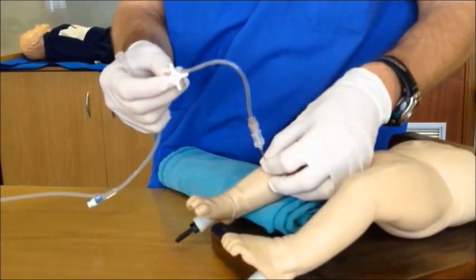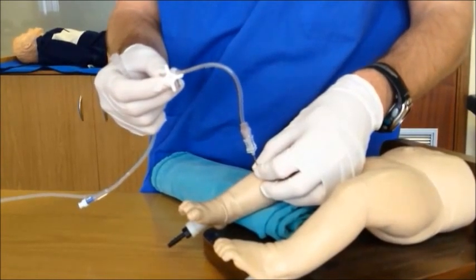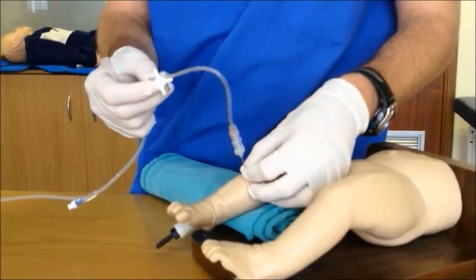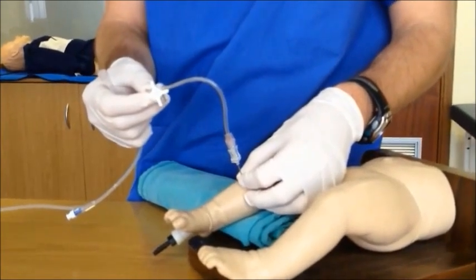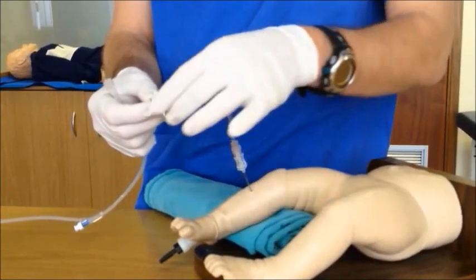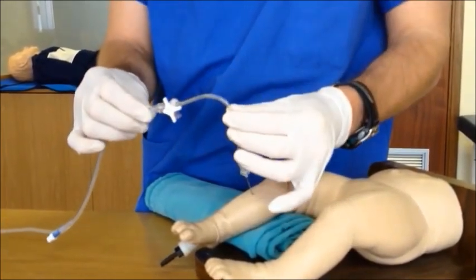We recommend that you maintain manual control of the needle until such time as all the initial essential and life-saving drugs and fluids have been given, as securing the needle to the leg itself may actually cause dislodgement. Once an assistant has taken over, attach your giving set.